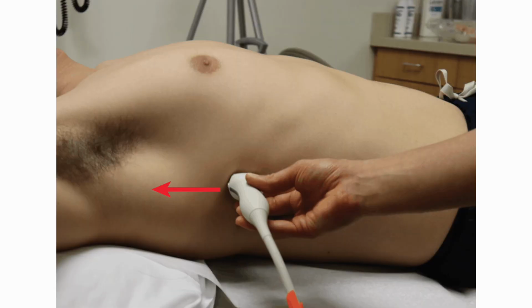So first we'll start with the right upper quadrant view. To obtain the right upper quadrant view, there's a couple different ways to do it. I usually start kind of mid-axillary line on the right side. You can also start at the xiphoid and run your way down the margin of the ribs, but you're just trying to get to where you would think the kidney might be.